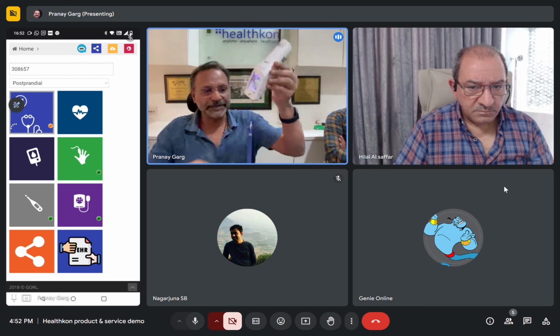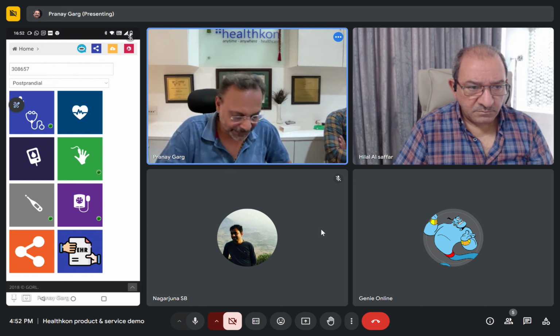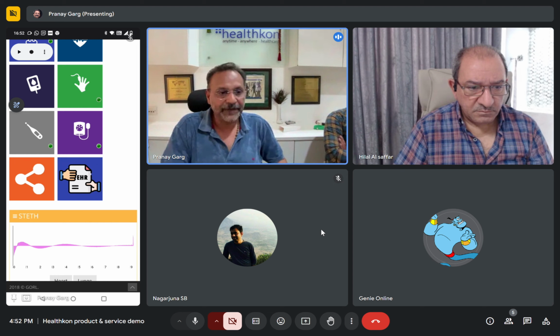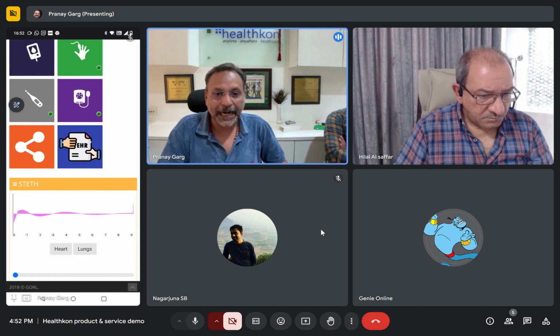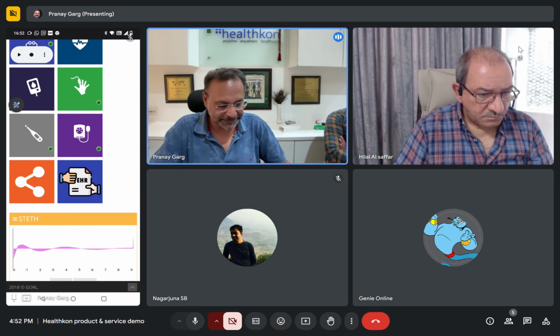Transferred to the phone. You can see that there is some transfer in progress, and I'm hoping this will transfer. Yeah, so you can see that it has been transferred. If I move it down, you can also hear it on the heart and lung filter. So you've got about 9 seconds of capture, and we will want to upload this.